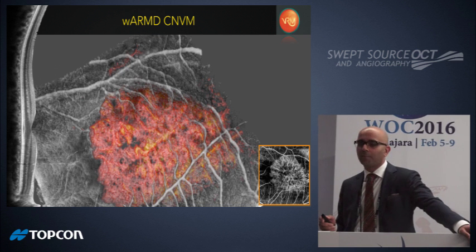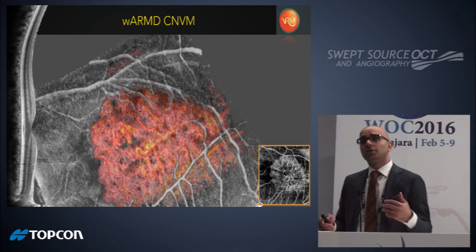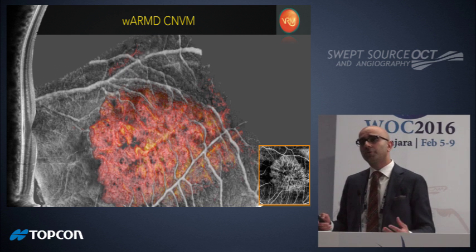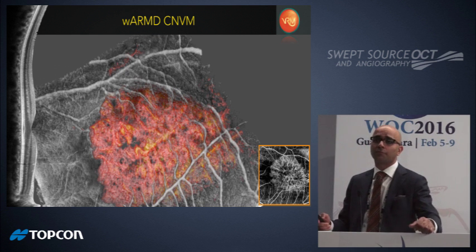Why is this important? I think as Vas mentioned earlier, we're learning to look at this data in a three-dimensional way. We're going to get better information about the underlying pathophysiology and potentially the management based on these three-dimensional relationships that we haven't really been able to look at before. So while it looks cool, the clinical applications of looking at the overall volume, the areas of non-perfusion, the areas of growth, these are all post-processing analytical software elements that we're going to, as clinicians, probably demand from industry.